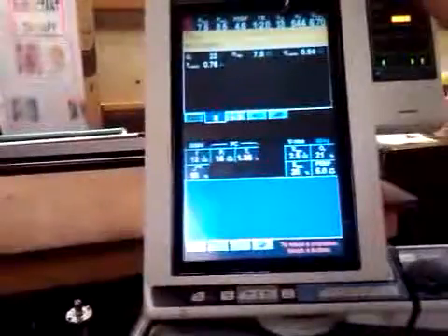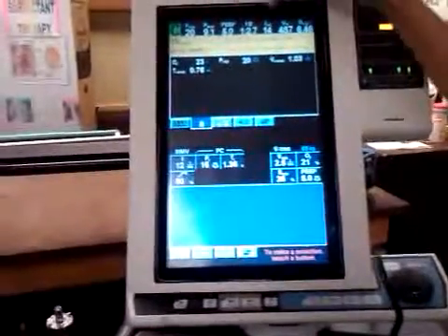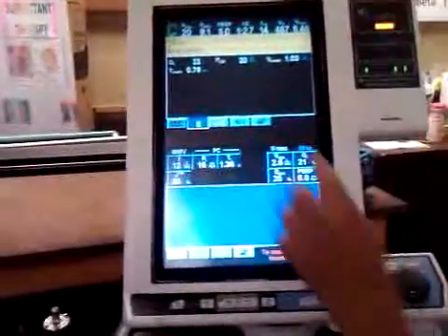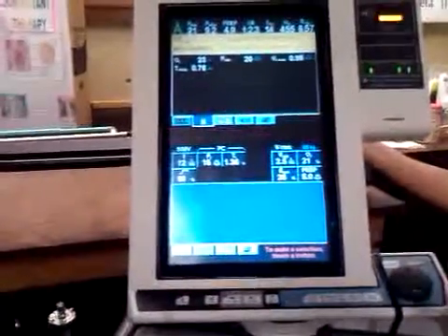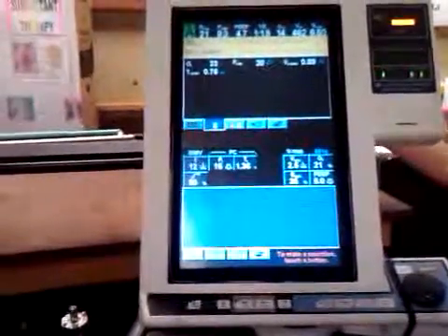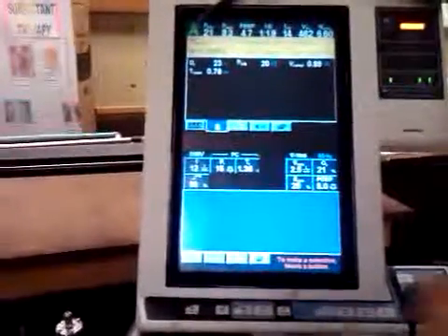No, she said to do it this far. Spontaneous, get your frequency, minute volume, and your spontaneous minute volume. You get 3 of them, right? Yeah, SIMV. So we need someone breathing for us. For SIMV, wait for it to be red and it says S.